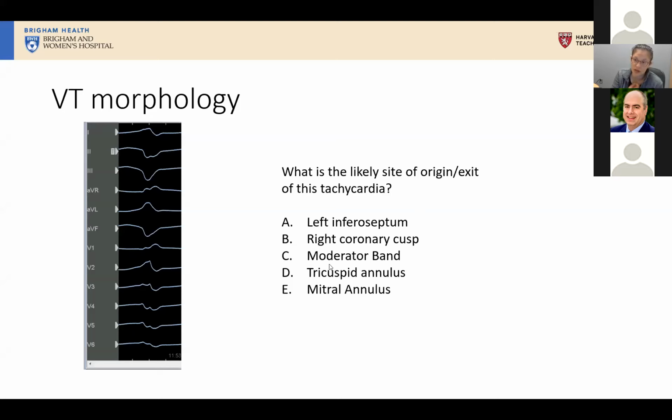But there is some data on using the coronary venous branches also for alcohol. I worry a little bit more that those are prone to collateral formation, which is why I haven't done it as much myself. I always think of those angiograms that we shoot as part of a CRT implant, where you do a balloon occlusion of the CS and inject it. You can see the entire heart light up with all the different branches, and so I'm a little worried that there's a potential for that, but there's definitely some experience with that, both in the middle cardiac vein and in the AIV branches.